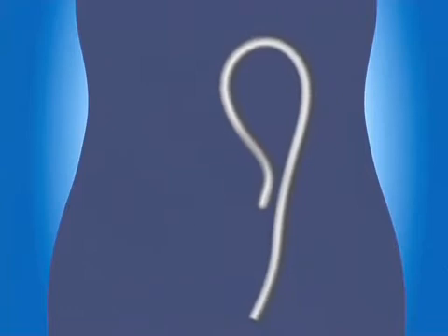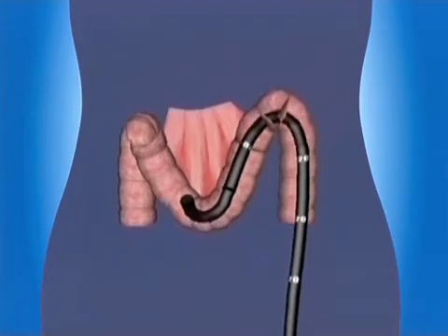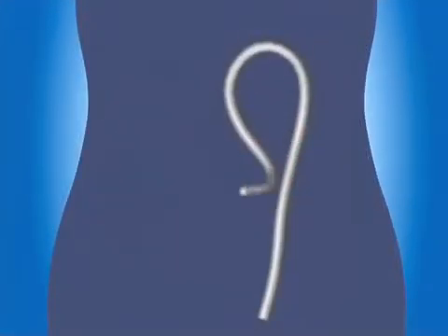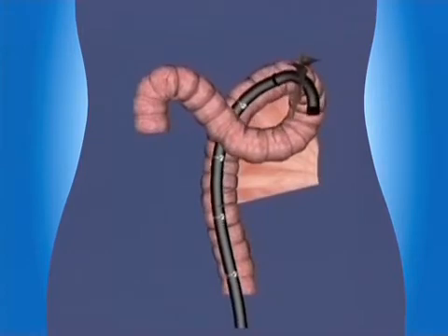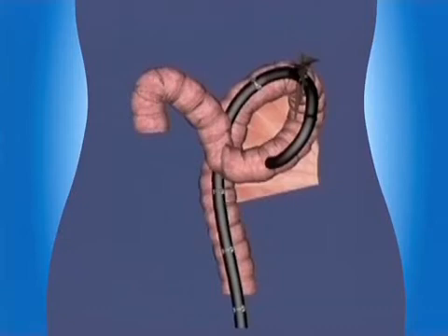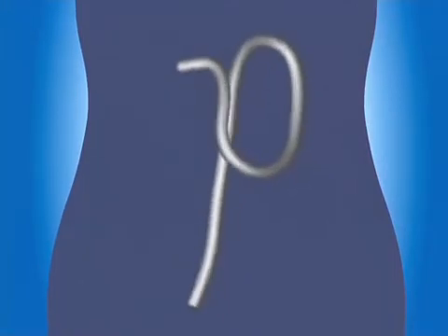After further manoeuvring, later on, a deep transverse loop forms. The endoscopist would reasonably expect that pulling back would lift up the loop, but actually the splenic flexure pulls down again because of its mobility. Next, because of the total mobility of the descending colon, which can move into the midline, scope pressure pushes the colon into a reversed splenic flexure configuration. Watch it happen on the imager view.